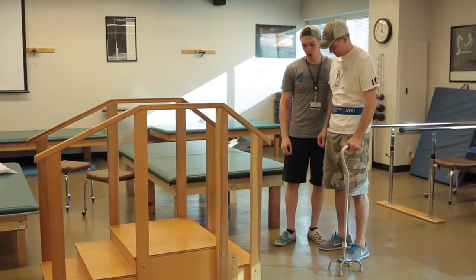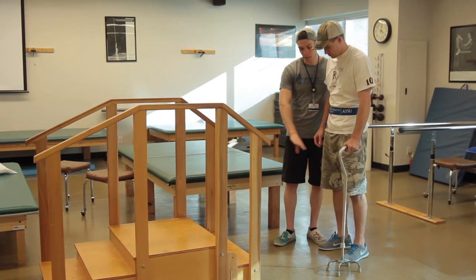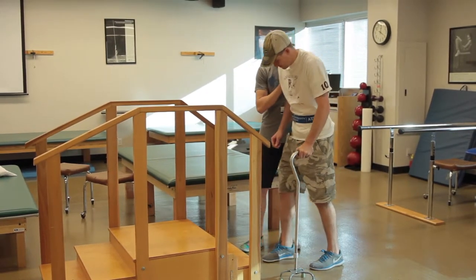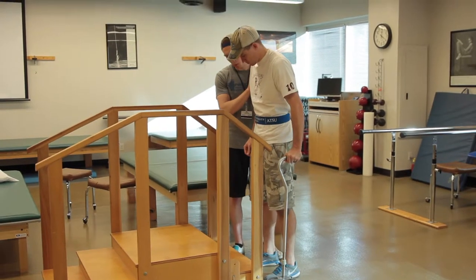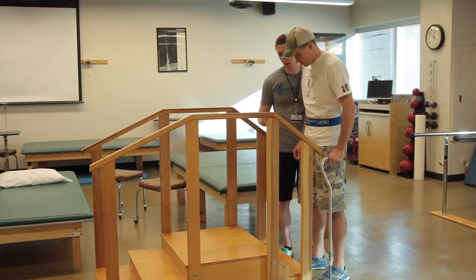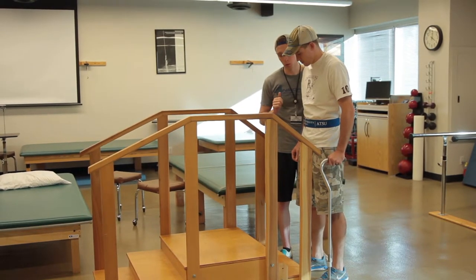All right, Dylan, you've done such a good job walking. We're gonna try these stairs next. So you're gonna go, same pattern, let's go up to the base of the stairs. Very good. All right, now this is gonna be a little bit backwards from what we've been teaching you. When you're going upstairs, you go up with the good. When you go downstairs, you go down with the bad or the involved, the painful leg.